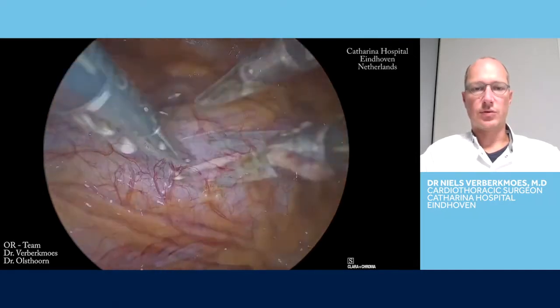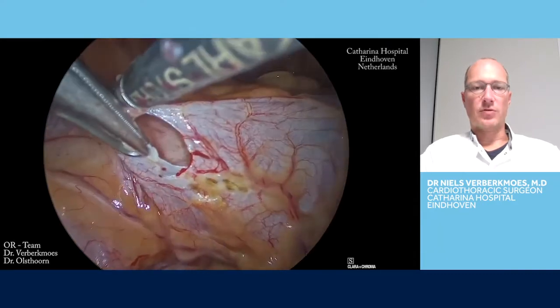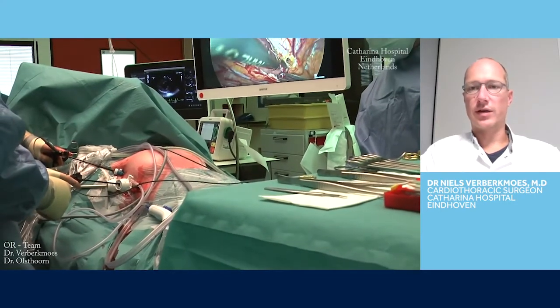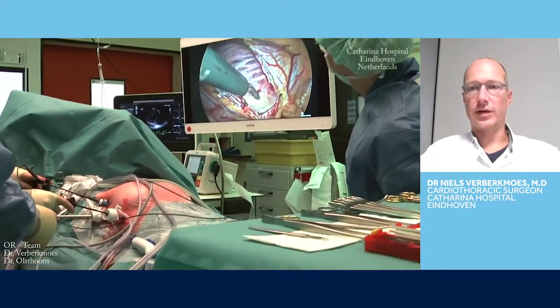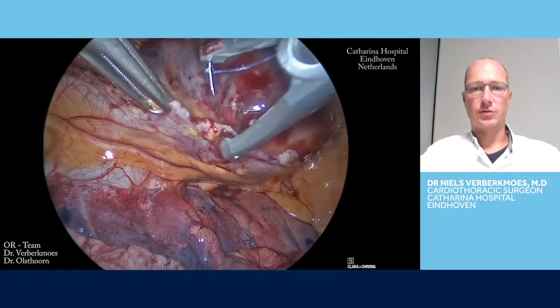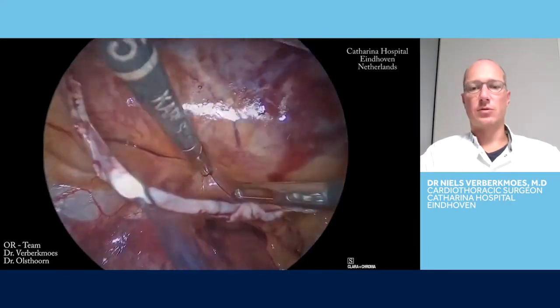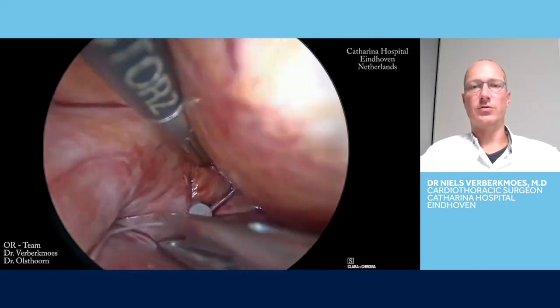The video switches to the right thoracic cavity. We open the pericardium above the phrenic nerve, and we stop at the end of the brachiocephalic vein. We open a little bit to the inferior cava vein. You can use a retraction suture to have a better exposure. It's not really necessary, but it could help you expose the pulmonary veins on the right.